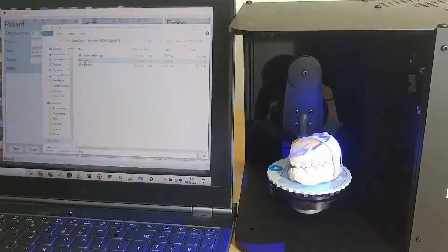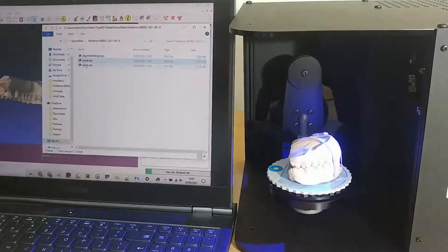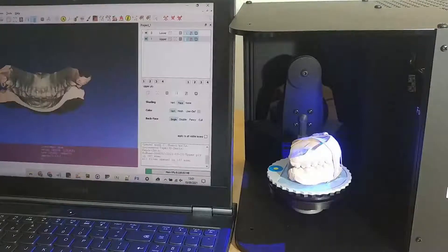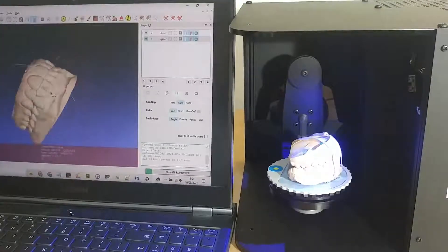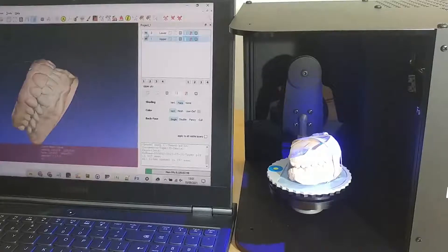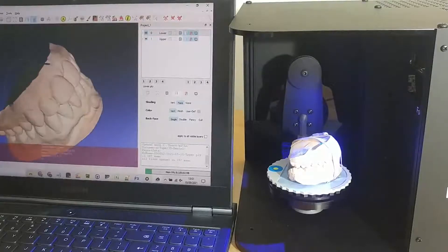So now if I load the upper and the lower model into MeshLab, we can see that both models align with each other perfectly. Ready for your next processing step or for sending to a lab.